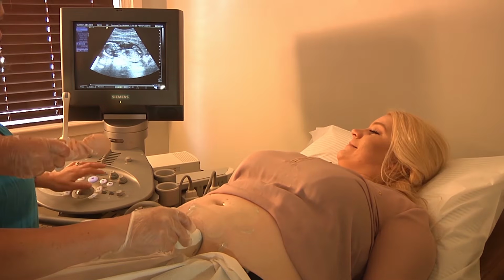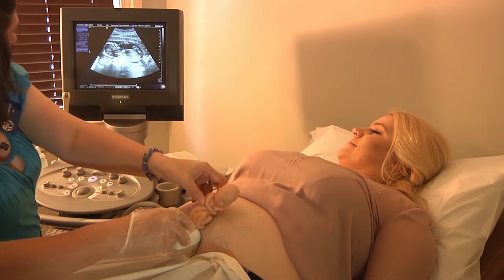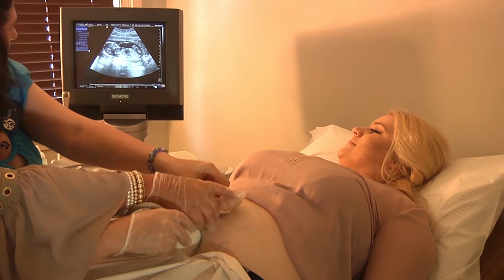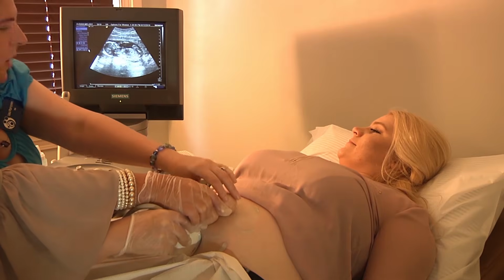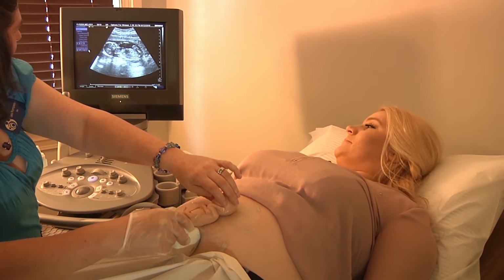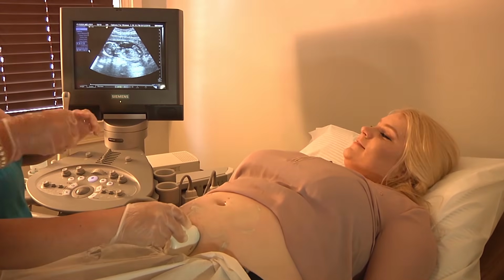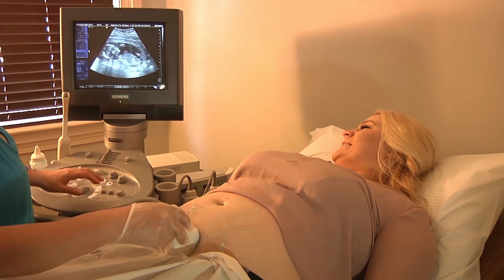Go ahead and place the baby on mom's tummy. Yeah, I think he's lying almost on his back. See how his back is up and down, front? Yes. So he's kind of lying like that. I like that one because it's a good profile. Yeah, it's good. Alright. Oh, now I got gel all over me. That's okay, we'll wash him.